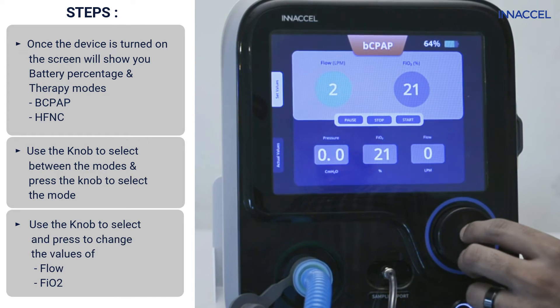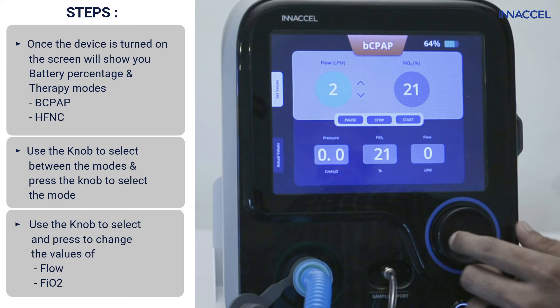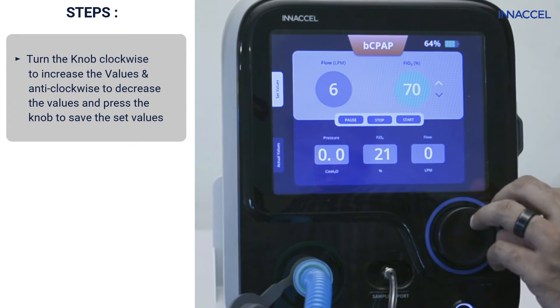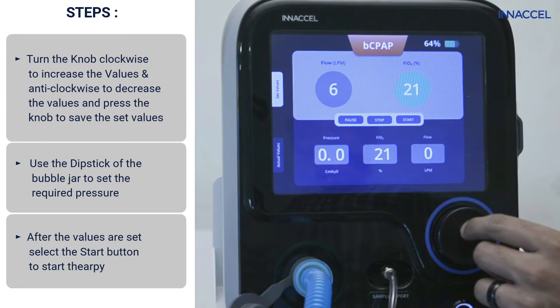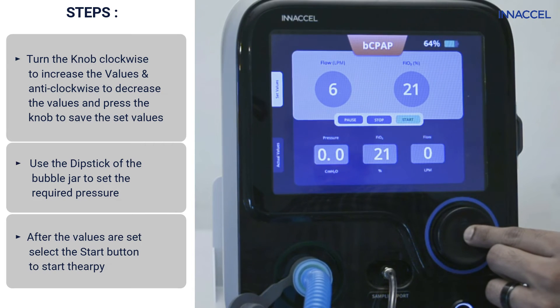You can also change the values of flow and FiO2 by using the knob. The knob can be turned clockwise to increase and anticlockwise to decrease the value. Use the dipstick and bubble jar to select the pressure you want to deliver. After you're satisfied with the values, select the start button to start the therapy.